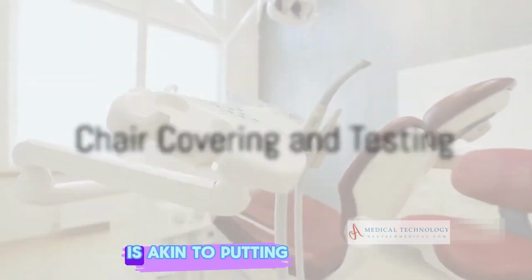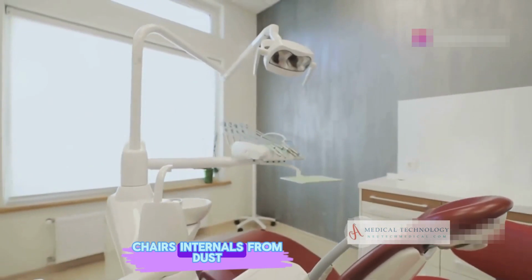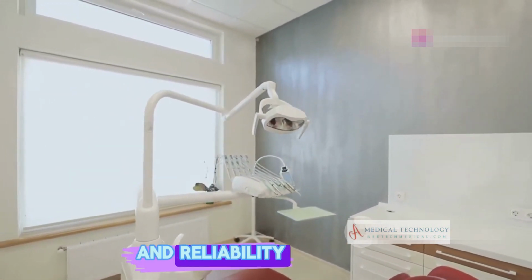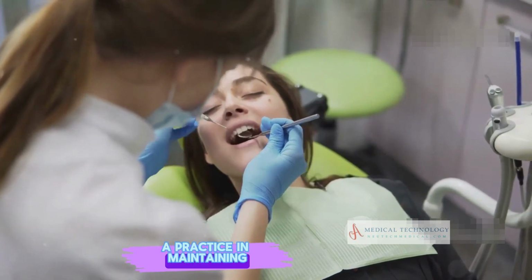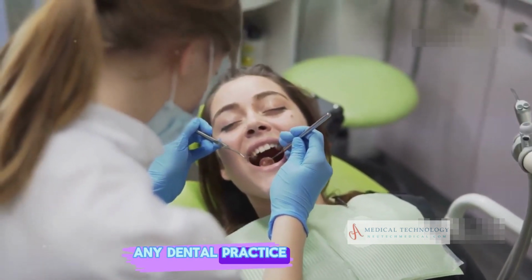Covering the chair with the provided lid or cover is akin to putting on the finishing touches. This step protects the chair's internals from dust and debris, ensuring longevity and reliability. It's also a practice in maintaining a pristine work environment, which is essential in any dental practice.